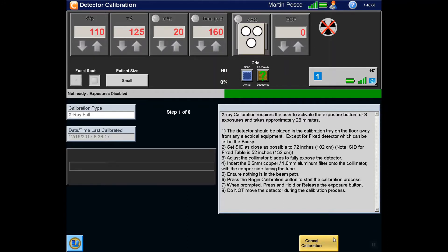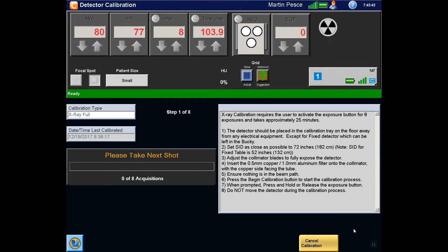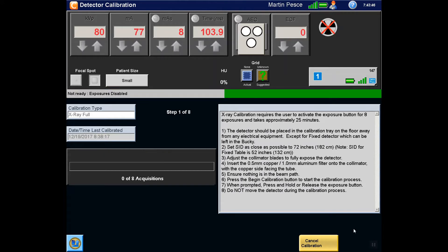Press the Begin Calibration button to start the calibration process. This will be an 8 step process and will take approximately 20 minutes to complete. Several steps will require no interaction by the radiographer. When prompted, acquire an image using the Prep Expose button as normal.